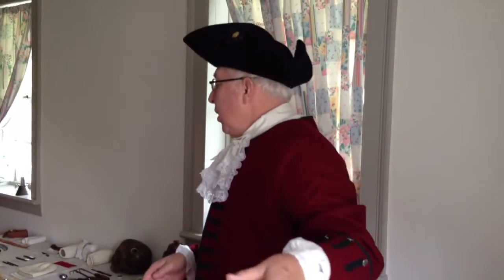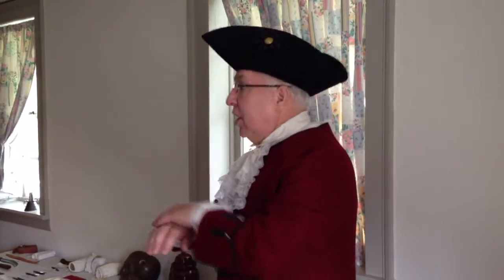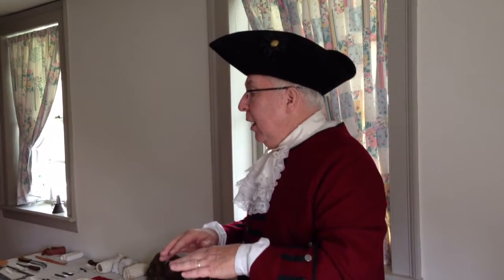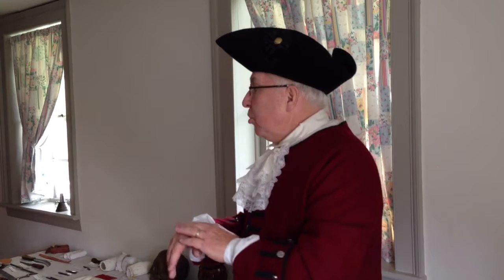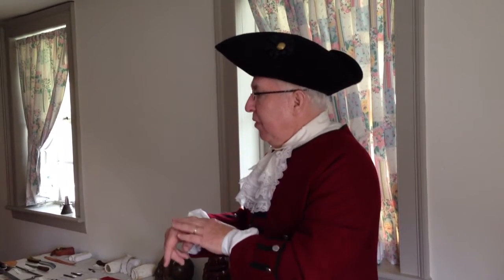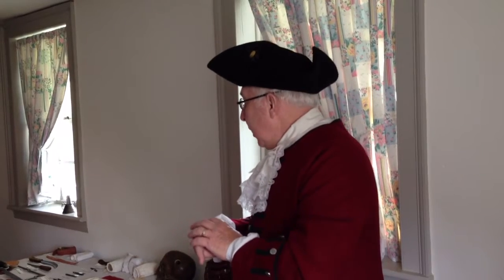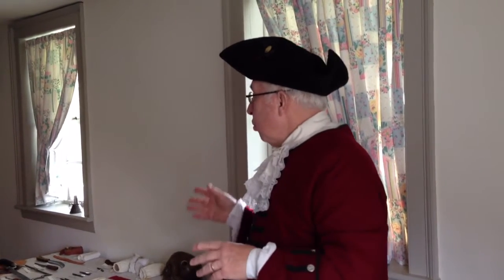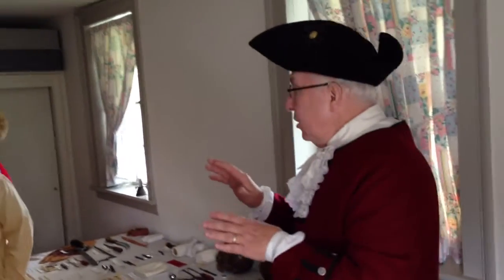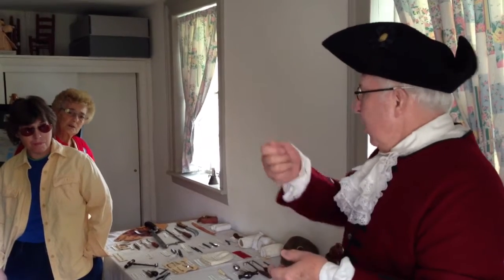The cautery also was used for treating little skin tumors, warts, skin cancers, you name it, or ulcers that weren't healing, which probably were skin cancers. You could burn everything out and it would heal up. Sometimes they would use that in surgery for not so much arteries but oozing veins that you just couldn't quite get stopped. You did it with the hot iron here and there.